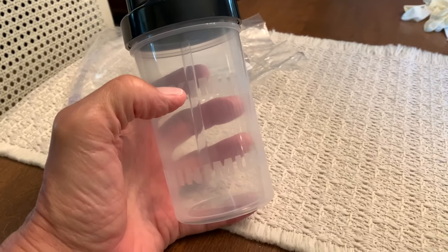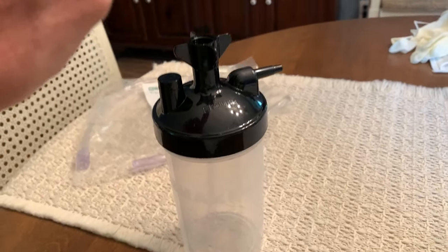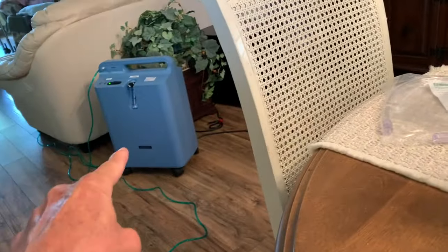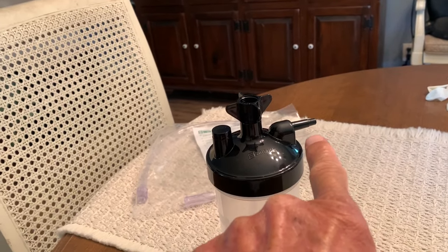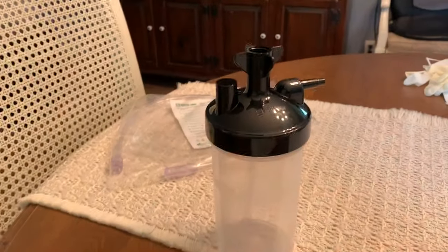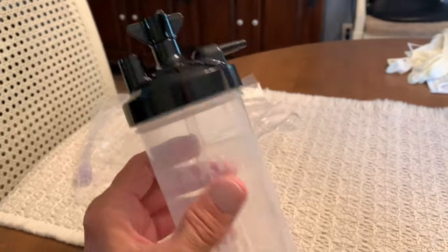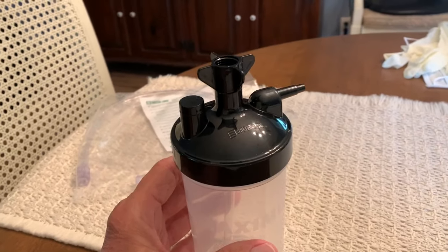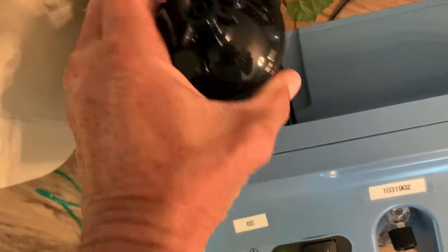We're going to hook up this humidifier to our oxygen concentrator right there — that's where you hook your line to. It goes to the patient, and it comes through the top. We need to fill it to the maximum line. Just behind the concentrator there's a little velcro loop that the bottle slips into.